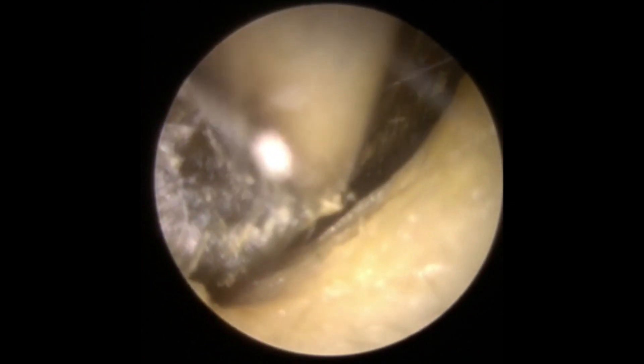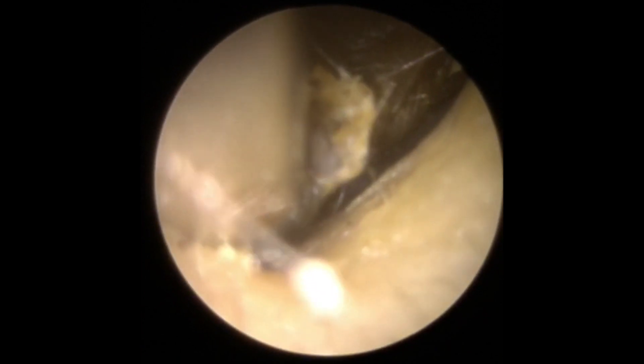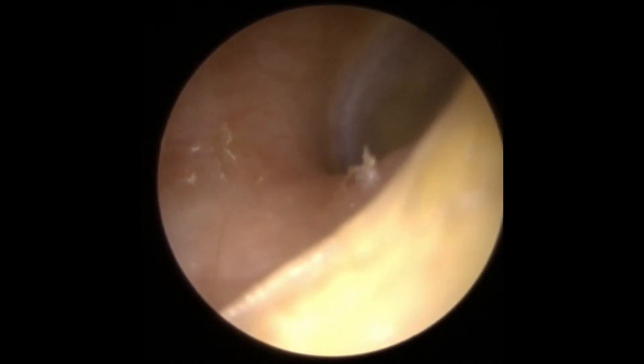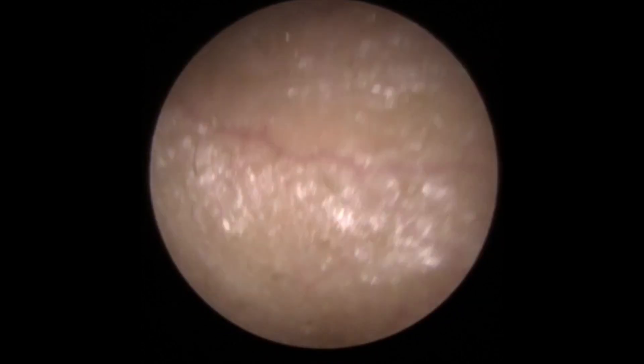There's a little bit of movement now — getting a little bit of purchase on this wax with tiny little movements, just lifting a little bit off the base of the canal. Not really budging as much as I'd like, so with a bit of a gap at the top, the Jobson Horn comes into play. Just going over the top of the wax, pushing down and bringing forwards, which allows us to get behind that bottom section. Where it's stuck at the bottom it just folds over itself — it's going to roll down the canal. All coming away. You can see how dry that back end was — two big chunks of wax connected together by a thinner piece. And there's the eardrum, all looking very healthy.